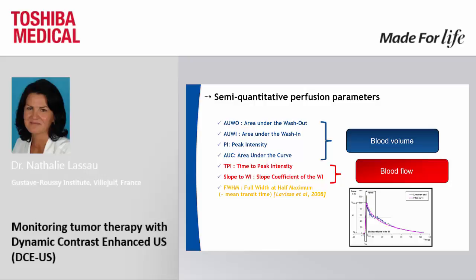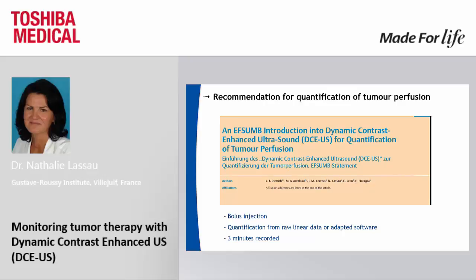So this methodology was published with European colleagues, Italian and German and UK, with EFSUMB, and we have a consensus in Europe. We inject the Sonovue during the bolus injection. We perform the quantification from the raw linear data or using adapted software. And we propose to record during 3 minutes the raw linear data. And if you evaluate the HCC, this is 5 minutes.